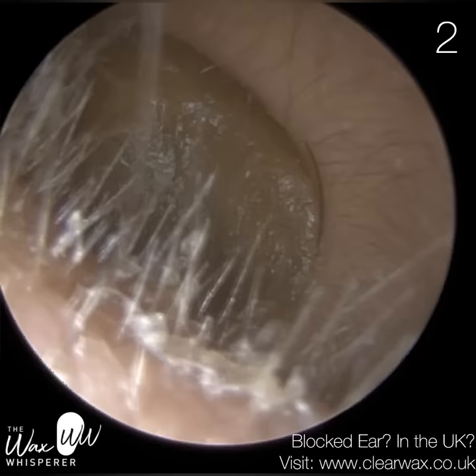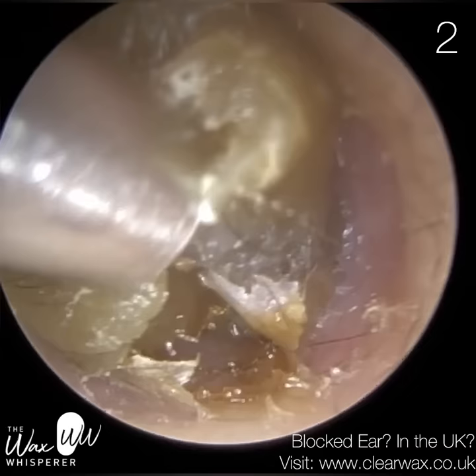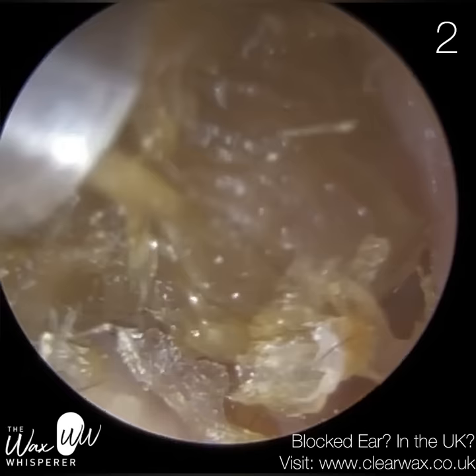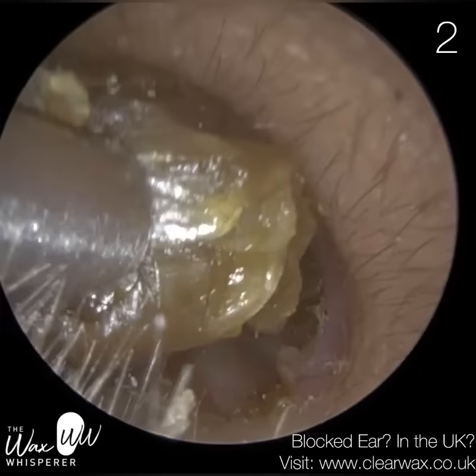This is procedure two — again it's fully blocked, a right ear this time, the other previous procedure was in someone's left ear. The wax in this particular patient was a bit softer, and I'm slowly just trying to tease this out. This is the more lateral wax near the entrance. You can see those hairs — whenever you see those hairs in an ear, you know we're on the outer third of the ear canal.